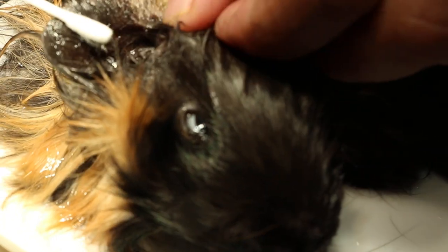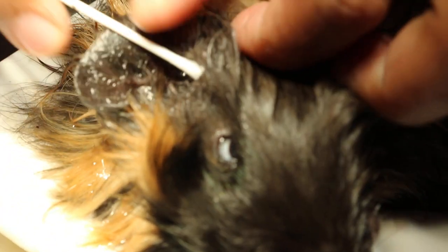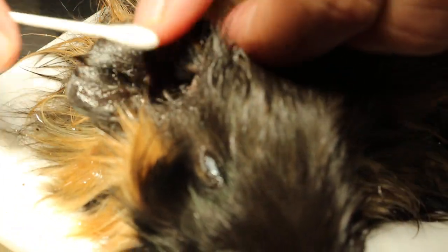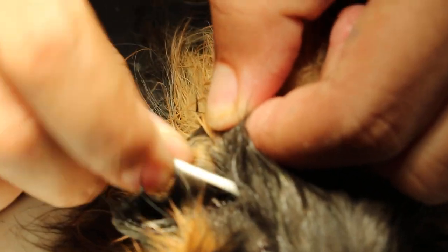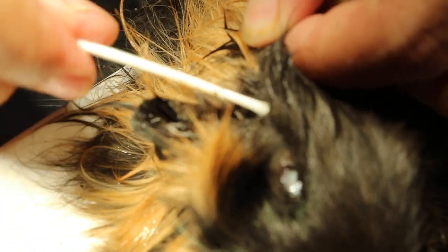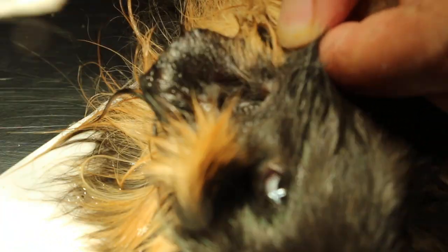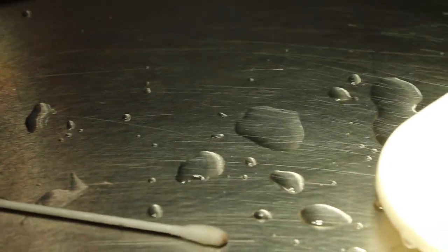We take a cotton bud — just got some cotton bud here. So we take out the anesthetic first. Let's check. Still very dirty. Let's take the thin one — there's a thin bud, not so fat.